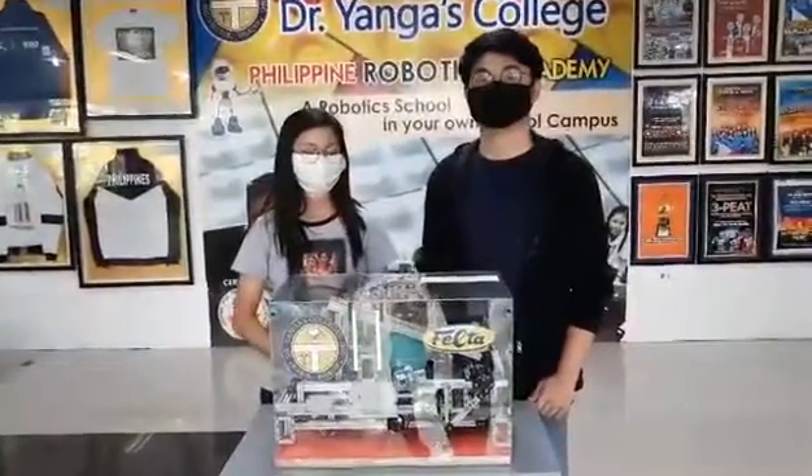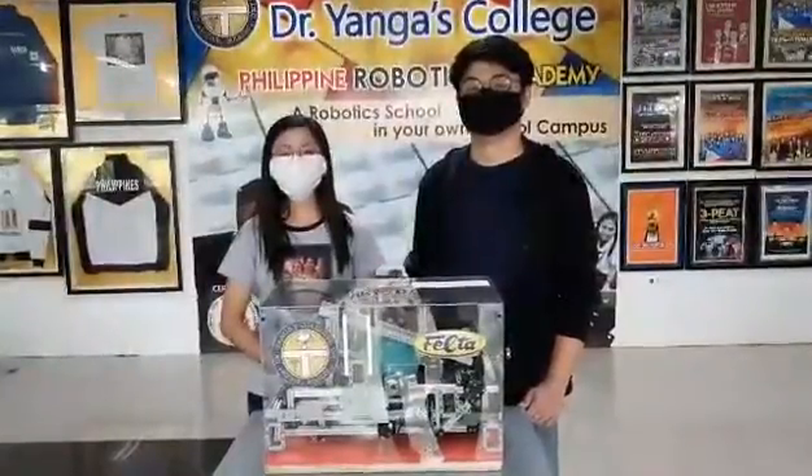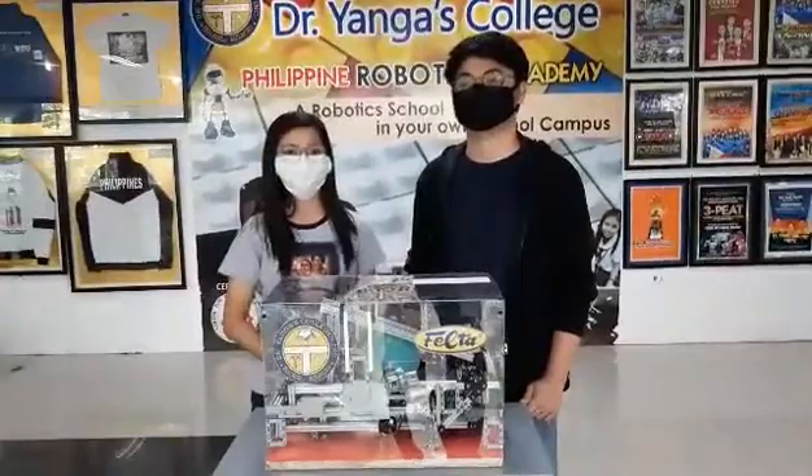The DYSA Robotics team made this robot to automate the use of an Ambu bag, or Artificial Breathing Manual Unit, as an alternative for ventilators.